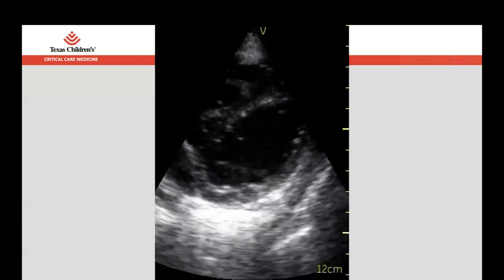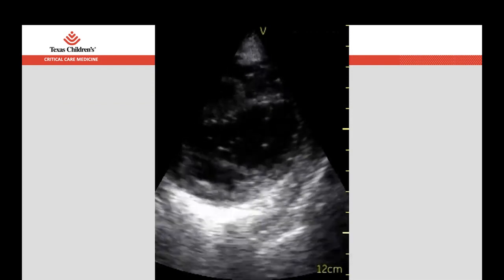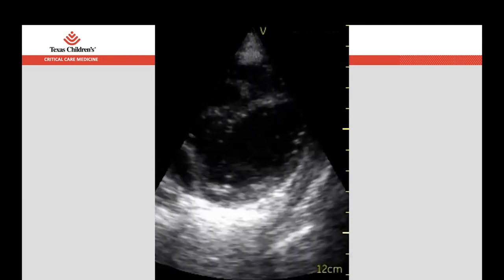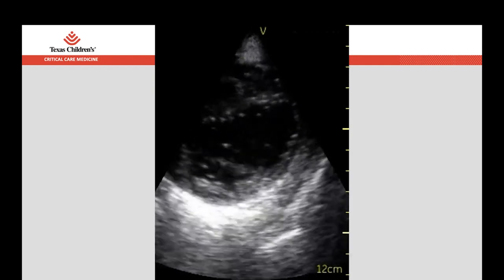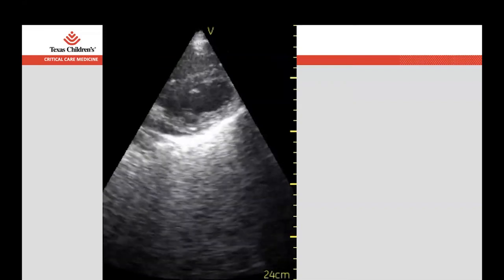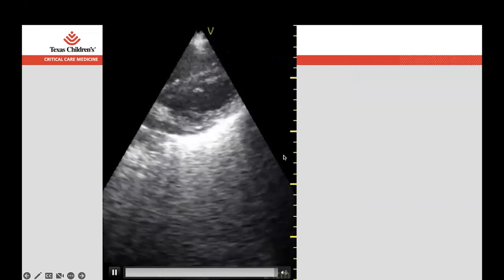And so you can have density differences in blood where we've got thickening blood, but it still might not be solid yet. Or you can have a fluid flush, which would be a density difference between water and blood, marked at the time that you're flushing, because of the composition of the saline as it squishes in. It isn't fully mixed yet, and so you get a little bit of a sonic reflection there. And then as arrest progressed, we ended up in standstill. I apologize that the depth was not correctly set here, but this heart stopped moving basically.